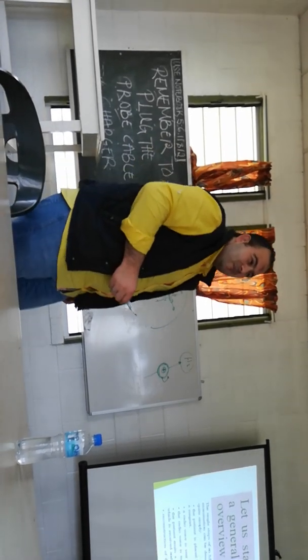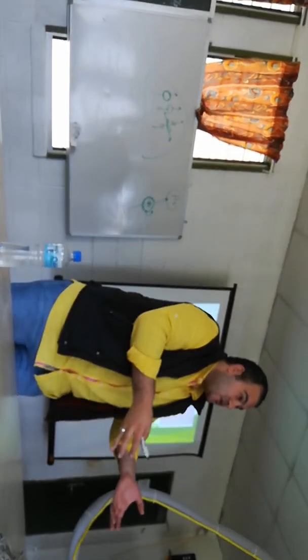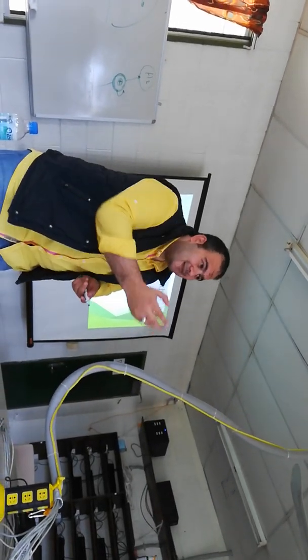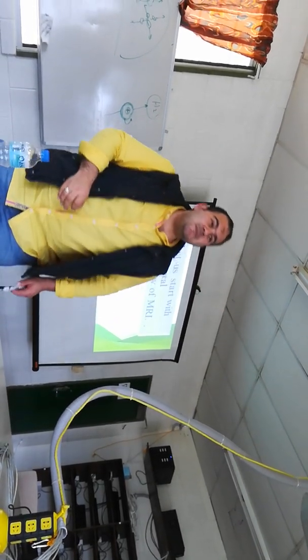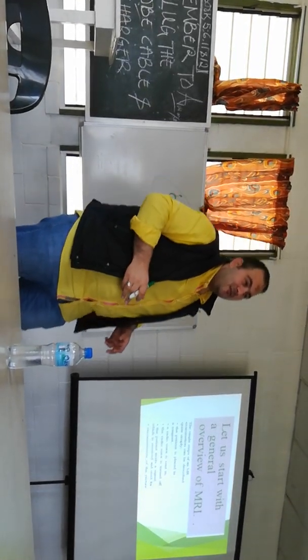Because now you have protons inside your body. These protons have a positive charge. This positive charge produces a magnetic field. So you have a magnetic field inside your body. And me, why are we not attracted? This is a question. Because your net magnetization is zero. That means that any two opposite forces neglect each other.